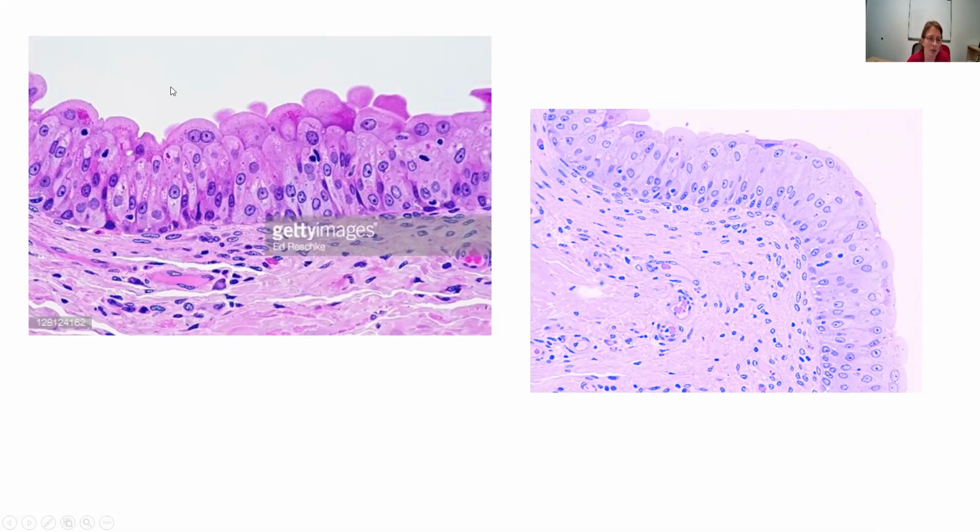And then what am I looking at? Well, these cells look kind of columnar, but this one just looks like it's kind of sitting on top. This one, I'm not sure. I am just not sure what's going on with this. So let me think. If I can't really figure out the cell type, it could be one of those special epitheliums. And this one is. This is transitional epithelium. And the reason this cell gives it all away for me is because transitional epithelium has weird cells with 2 nuclei in them. Here's another one right here. There are 2 nuclei in this cell. Over here, working my way around, some of these maybe, but oh look, right here, there's 2 nuclei.